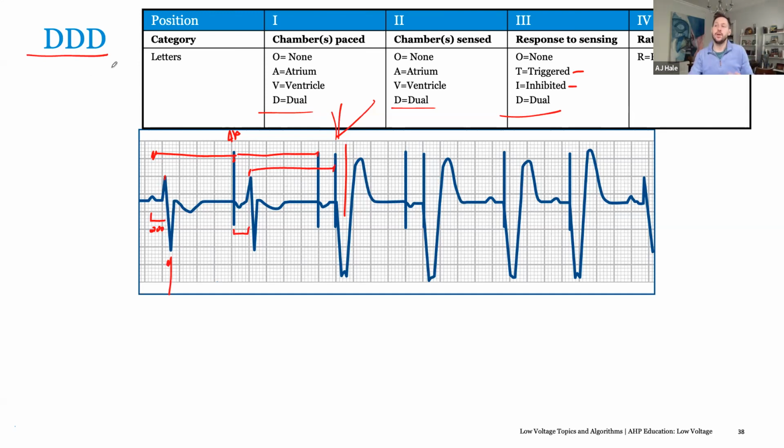So this is going to be most advantageous for patients because when the atrium speeds up, we follow what the atrium is doing, right? So we maintain that atrial synchrony above the base rate of 60 BPM. That means if a patient is going 80 beats a minute in the atrium, we can then follow that and make sure we're pacing accordingly.